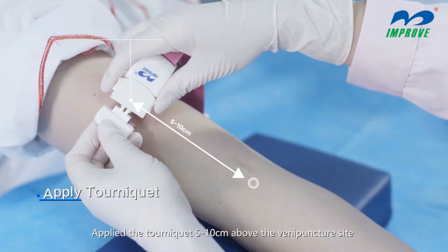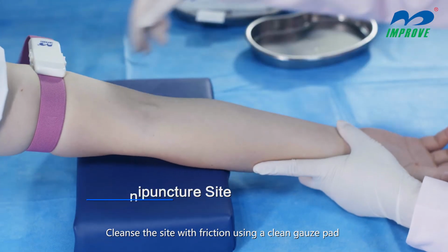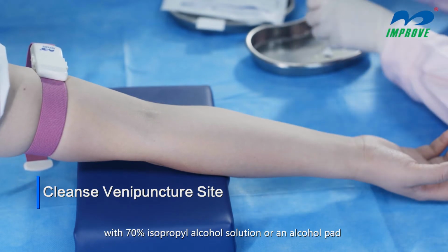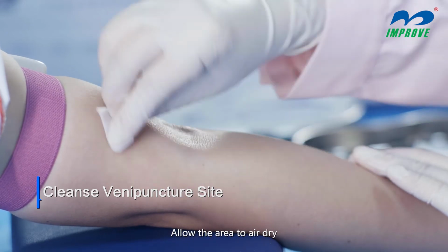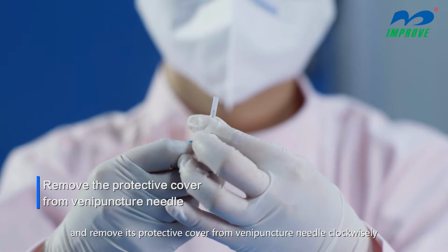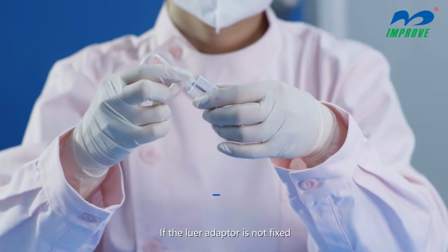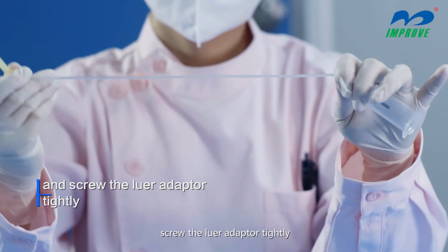Apply the tourniquet 5 to 10 cm above the venipuncture site. Cleanse the site with friction using a clean gauze pad with 70% isopropyl alcohol solution or an alcohol pad. Allow the area to air dry. Take the safety blood collection set and remove its protective cover from the venipuncture needle clockwise. If the luer adapter is not fixed, screw the luer adapter tightly.